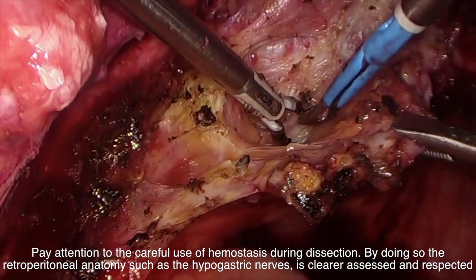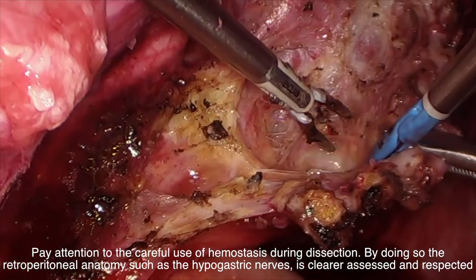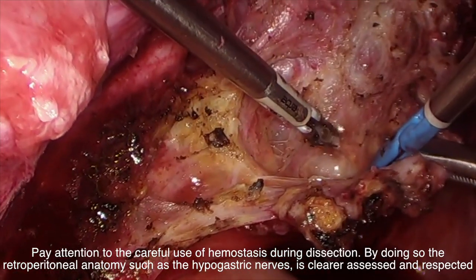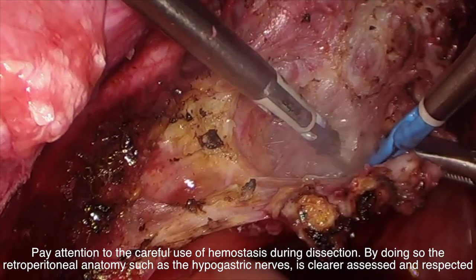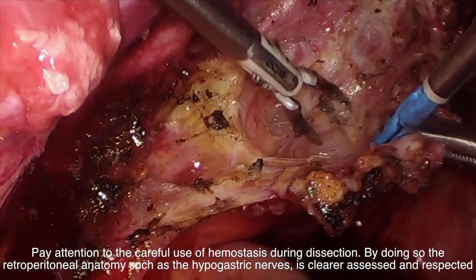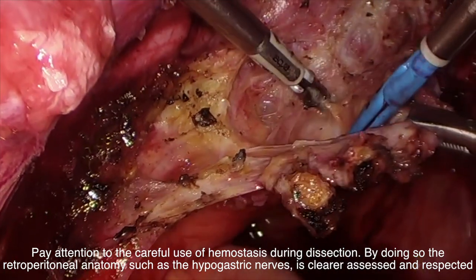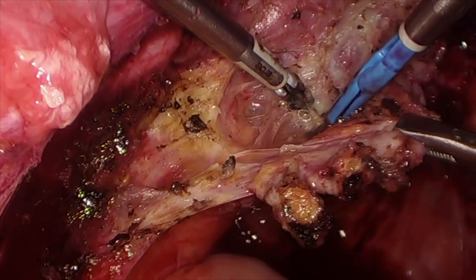Pay attention to the careful use of hemostasis during dissection. By doing so, the retroperitoneal anatomy, such as the hypogastric nerves, is more clearly assessed and respected.